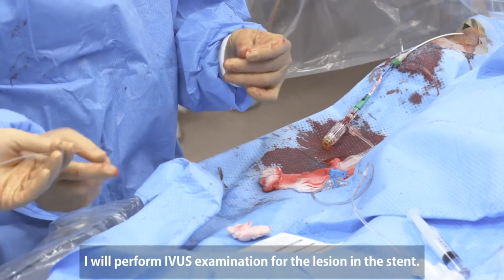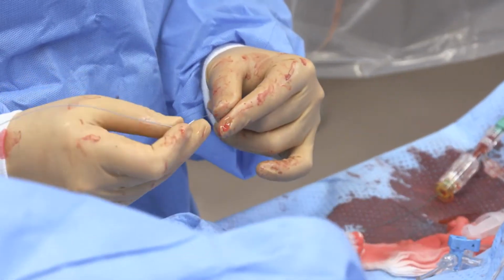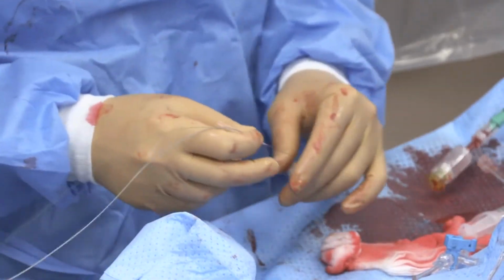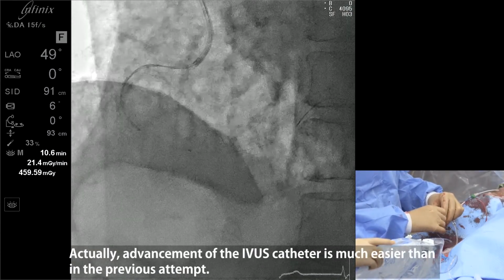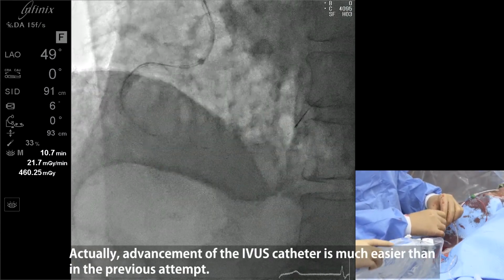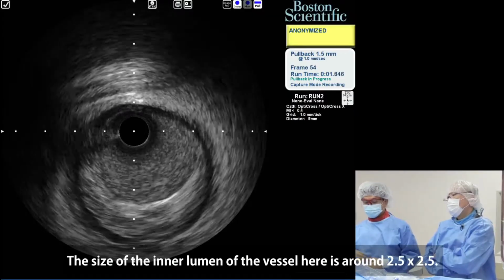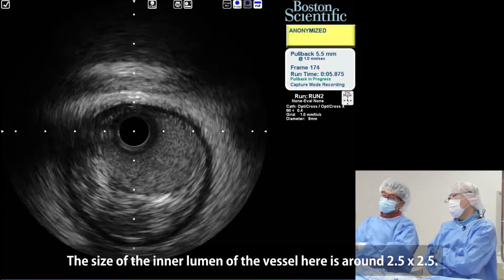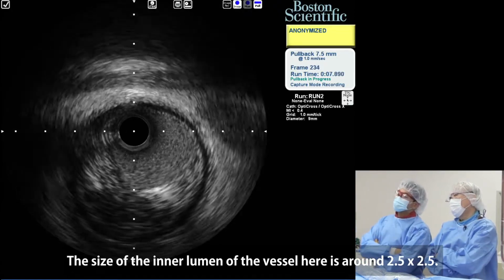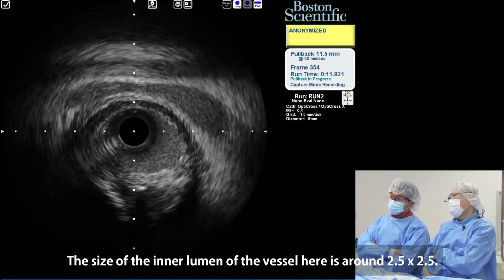I'll perform IVUS examination for the lesion in the stent. Actually, advancement of the IVUS catheter is much easier than the previous attempt. The size of the inner lumen of the vessel here is around 2.5 by 2.5.